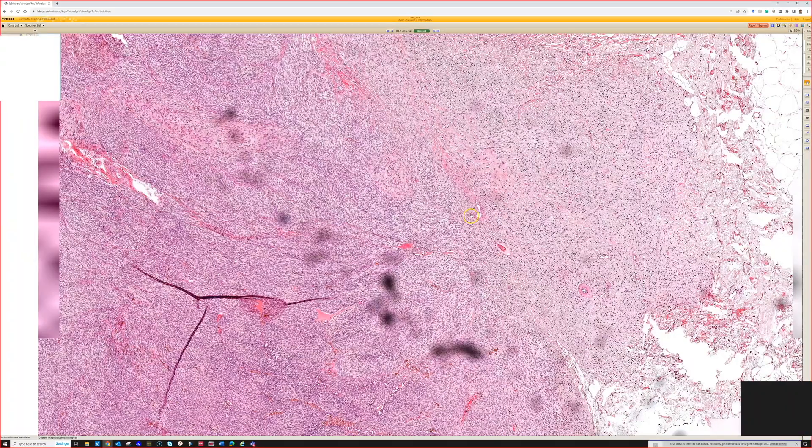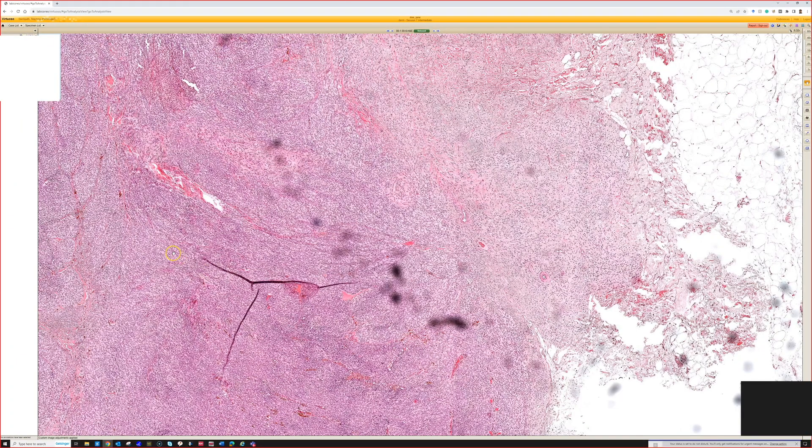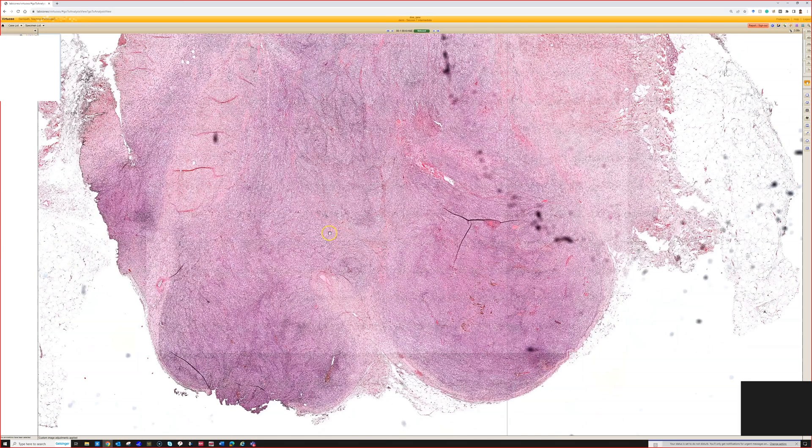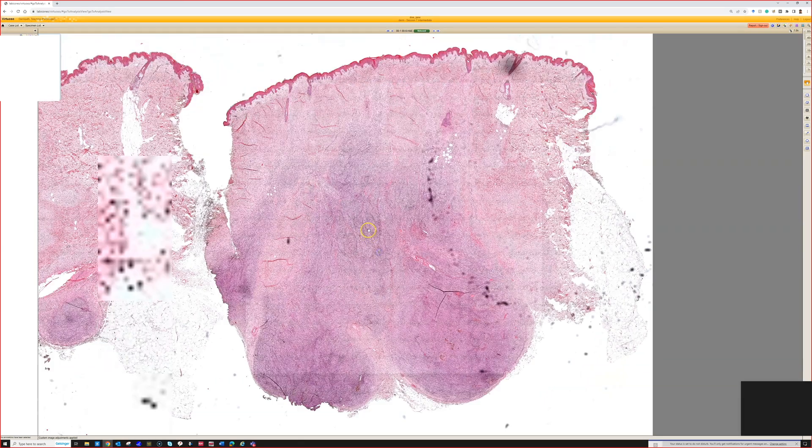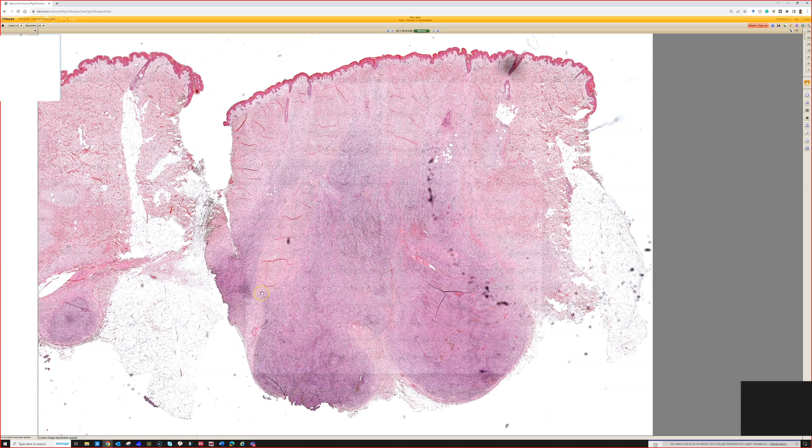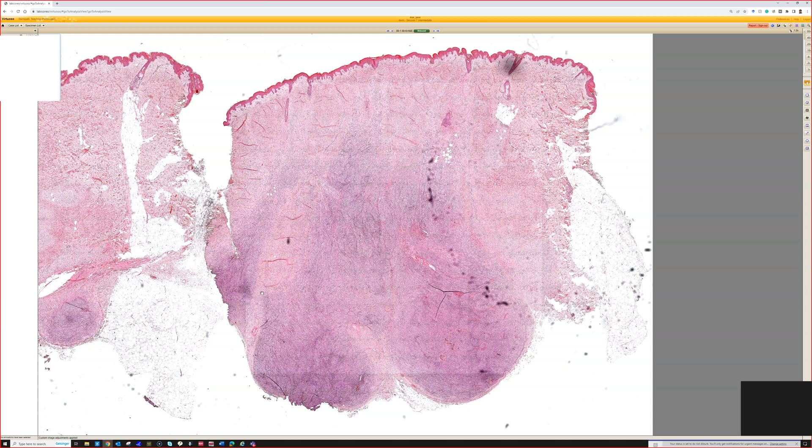This is cellular blue nevus. The first thing, just like you pointed out from low power, these have a bulbous or dumbbell-shaped protrusion pushing down deep. They violate the rule that melanocytic lesions should mature with depth—that is, the cells get smaller and arranged into smaller units and single cells that trickle between the collagen. This does the exact opposite of that.